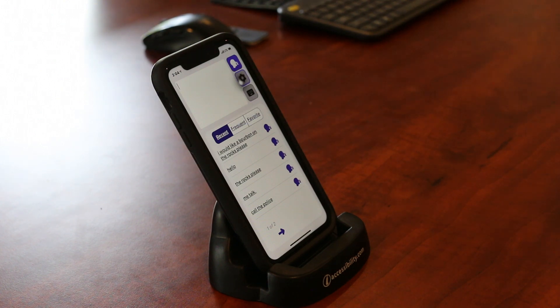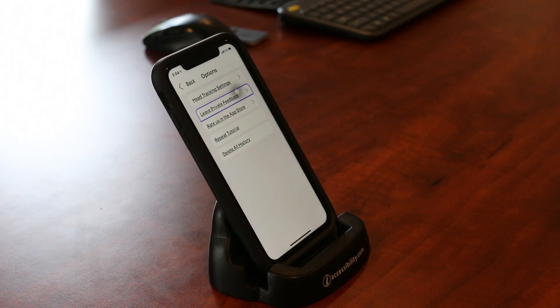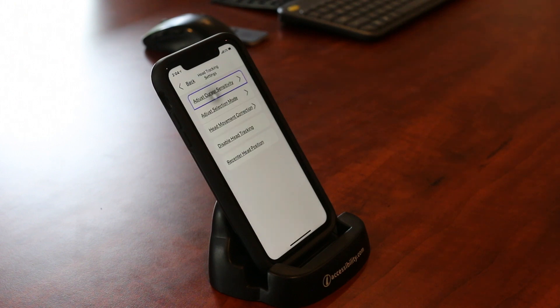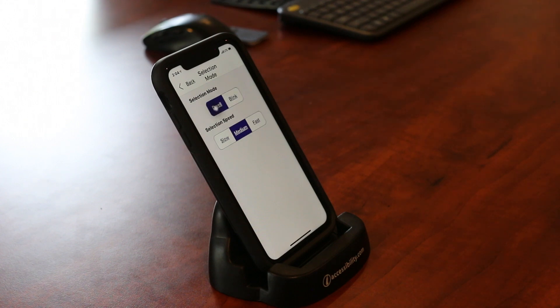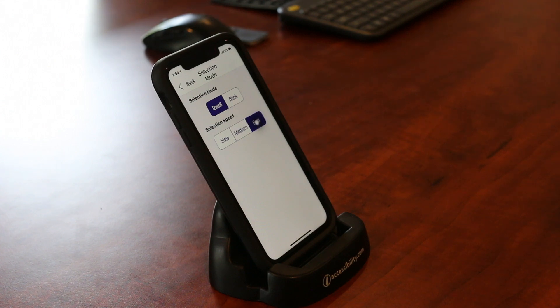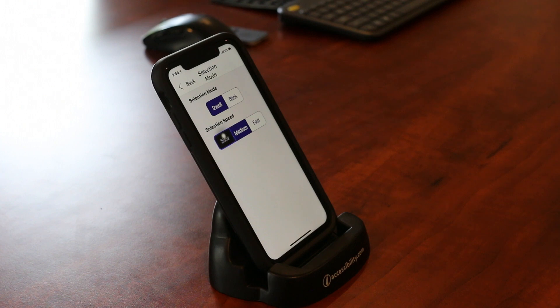If I don't like the settings, I can come up here and change some different things. So I can change the head tracking settings, change the cursor sensitivity. I can also adjust the selection mode. So I like to select things by blinking at them — I just find it a little bit easier — but I can also dwell. To dwell, I just have to hold my head onto a selection for a little while and it will pick that selection, just stopping that cursor and letting it dwell over something.